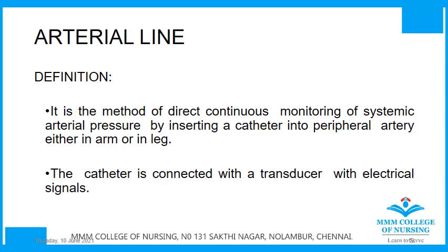Definition: it is the method of direct continuous monitoring of systemic arterial pressure by inserting a catheter into a peripheral artery, either in the arm or in the leg. The catheter is connected with a transducer with electrical signals in it.